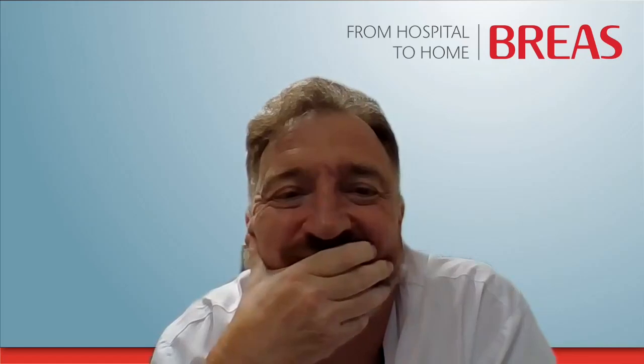Okay, great. And then the last question, I kept this one for last as it has Breas in the question. There is one of the attendees saying, I know that Breas' newest devices allow for the addition of effort belts. Do you think these are useful, and if so, when? Absolutely, yes. For the second and third step of the reading procedure, the belts are useful.